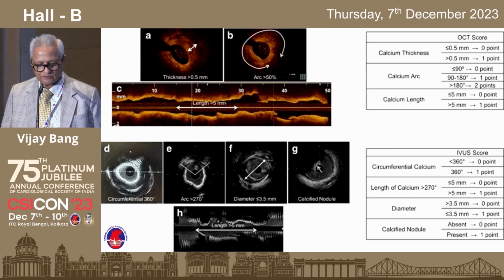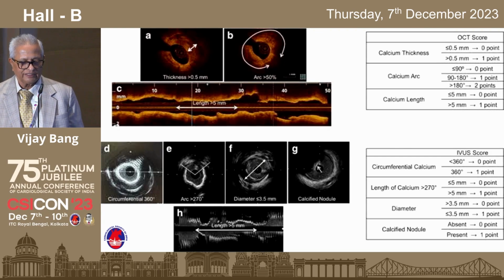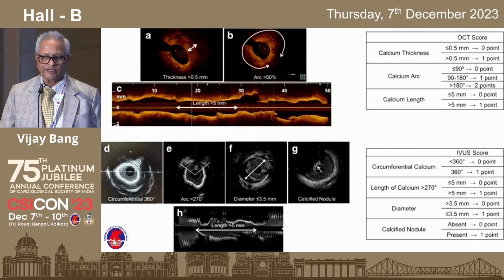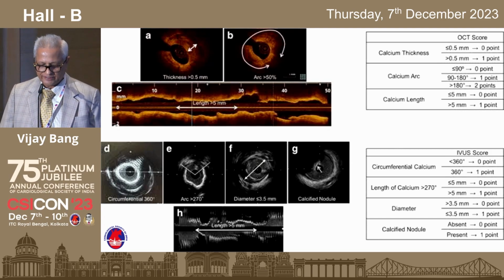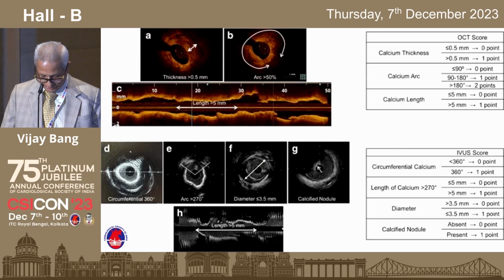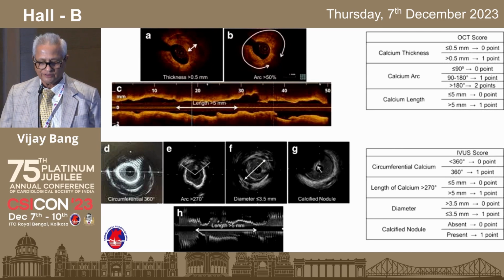For calcium, there is a score system to decide whether we need to do the atherectomy or a cutting balloon is good enough, based on the arc. Basically, arc is the most important criteria. If the arc is more than 270 degrees, we have to consider the atherectomy device.